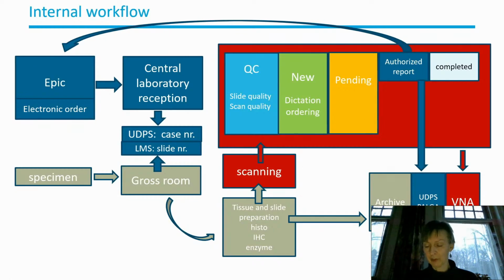Unfortunately, our storage is not yet very large, so at the moment we can store the slides for about 3 months, but we are desperately trying to extend that. You would like to store everything forever, but a year would already be very nice.